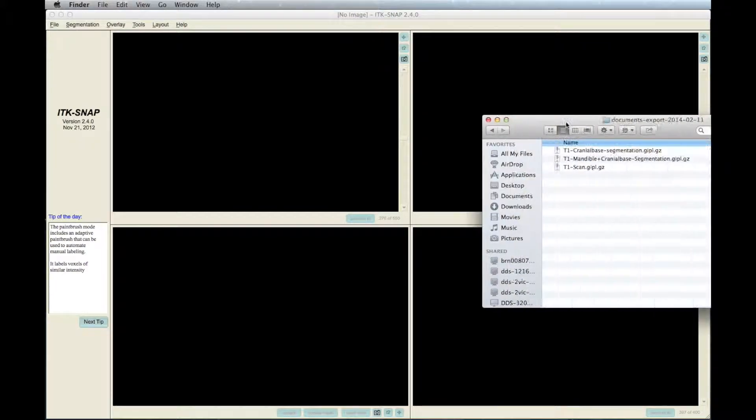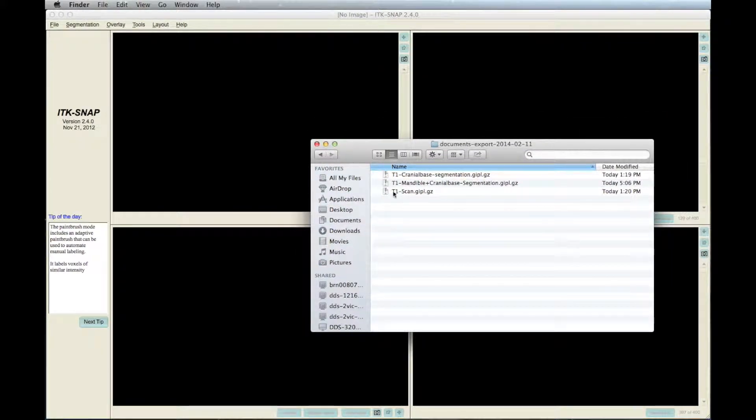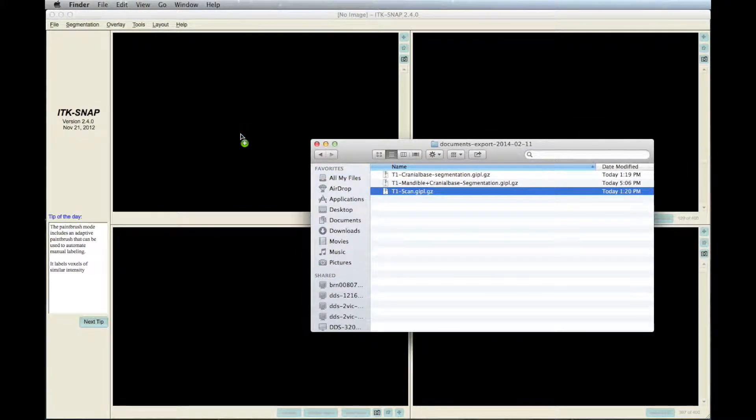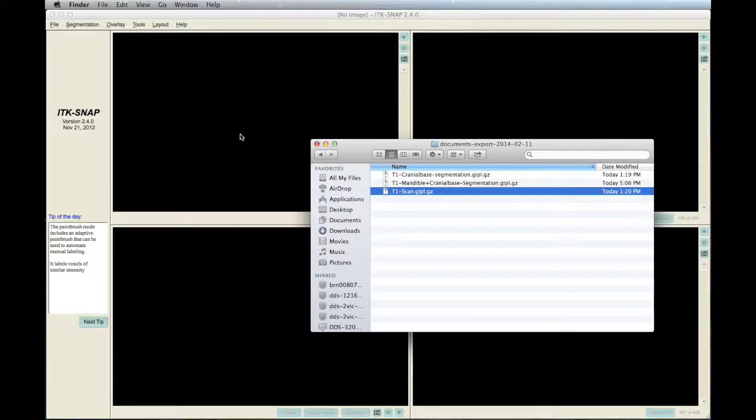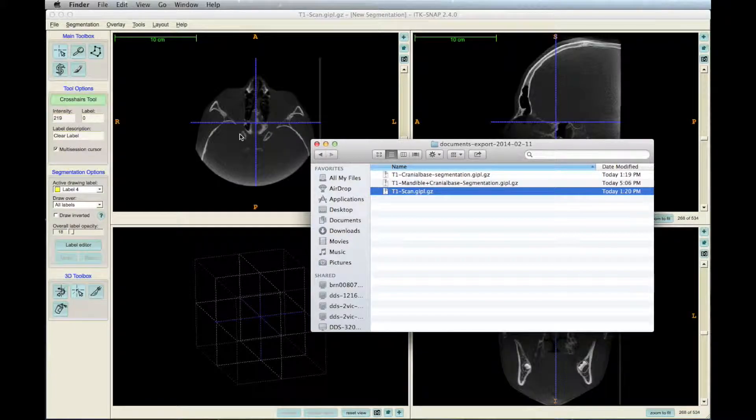Load the scan - CT, CBCT, or MicroCT - into ITK-SNAP. Here, we simply loaded it using the drag and drop method.